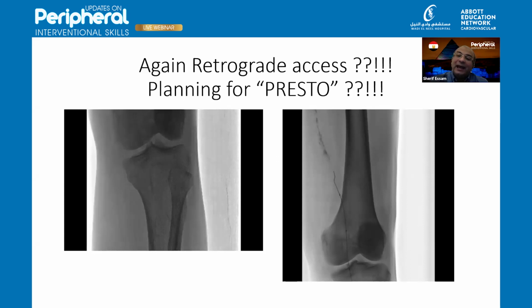At the same time, you need a highly flexible stent because you're going to implant a stent in the groin, in the common femoral artery, and another stent at the Hunter's canal, which are the two most important segments in the lower limb liable to torsion forces, stretching forces, and compression forces. So that's why I was thinking about the Supera in particular. Alberto, what do you think?